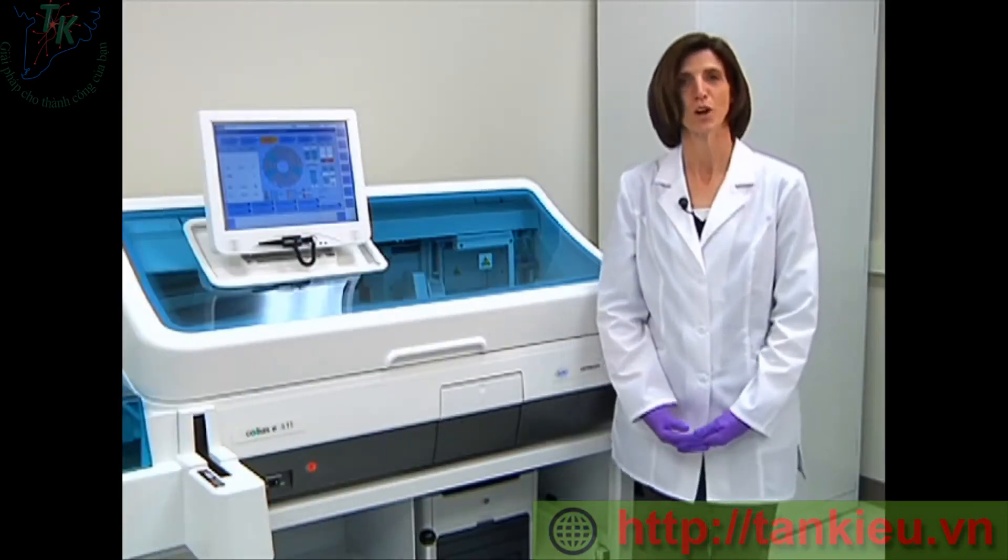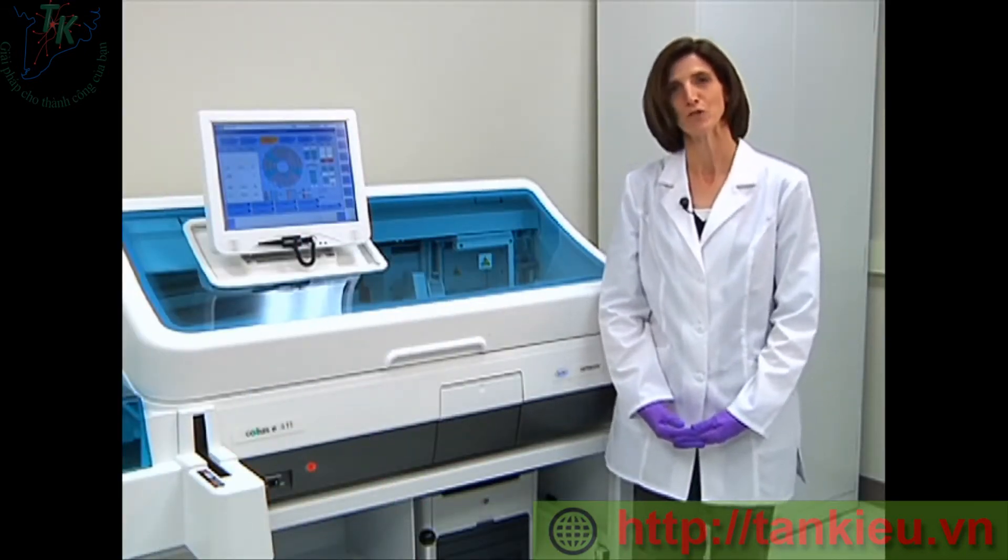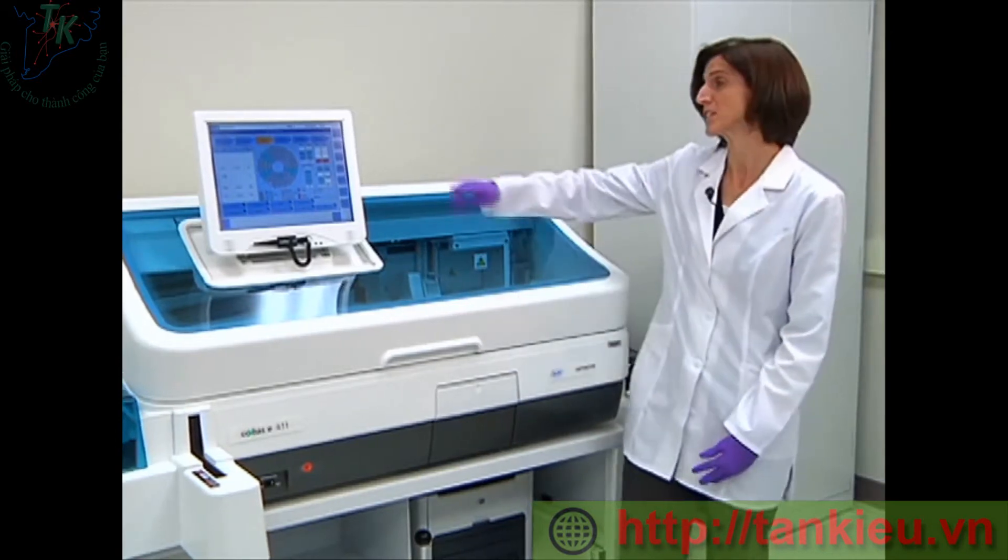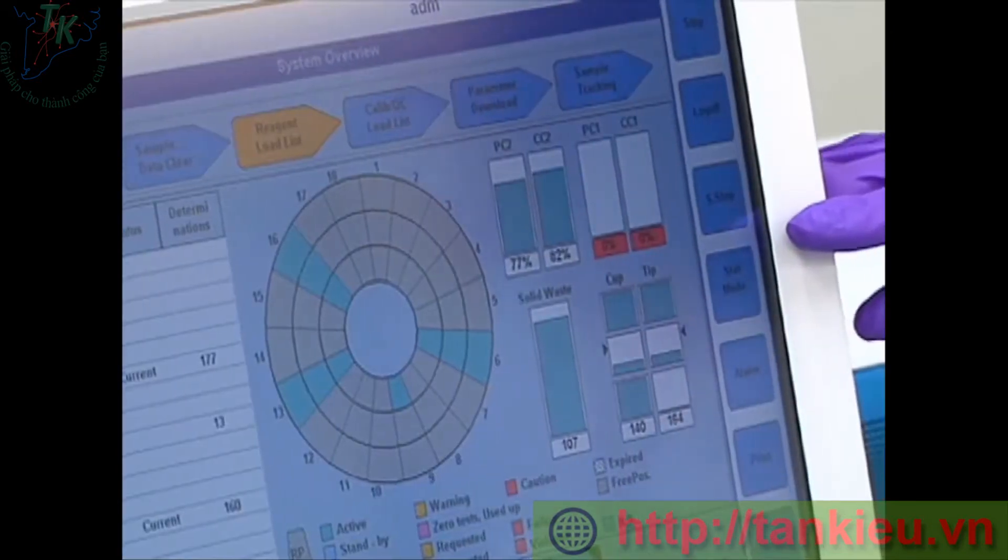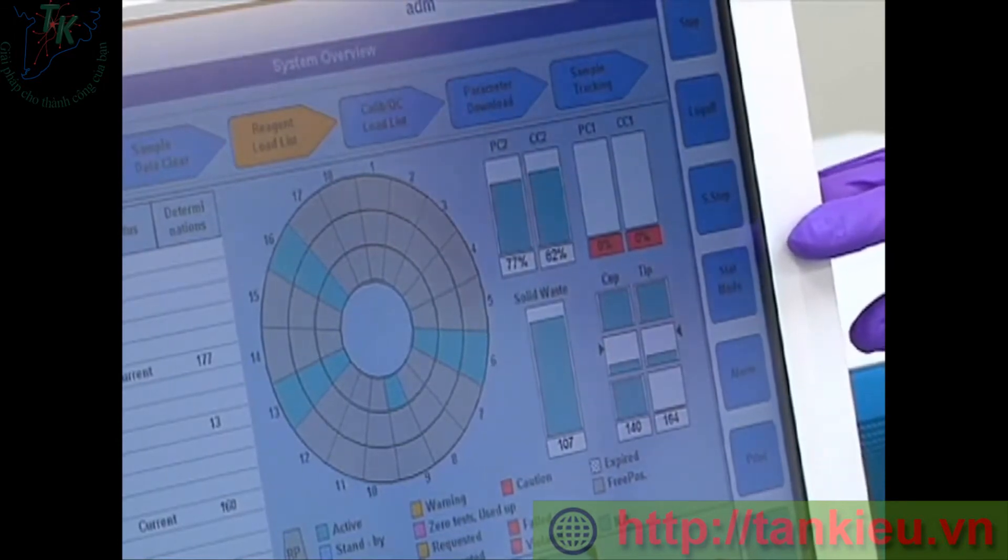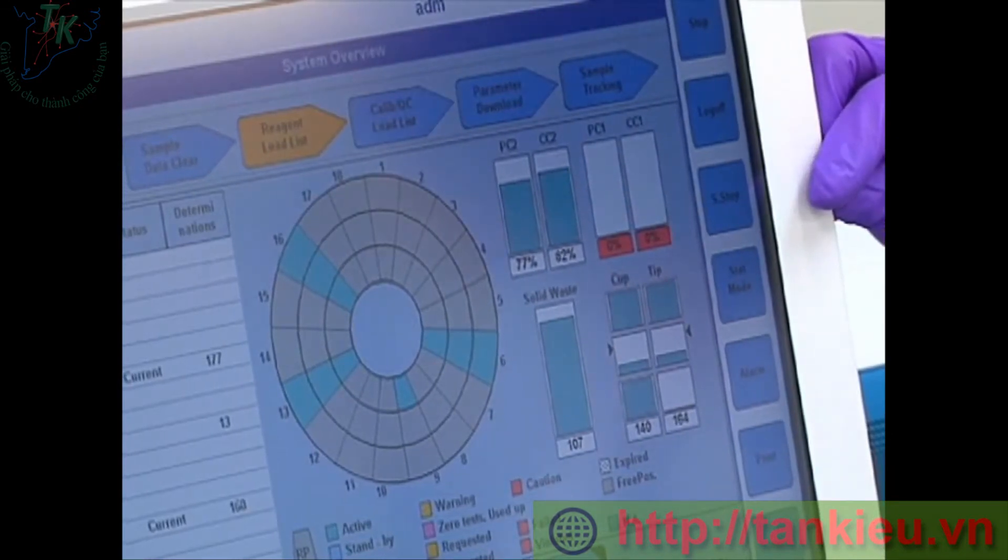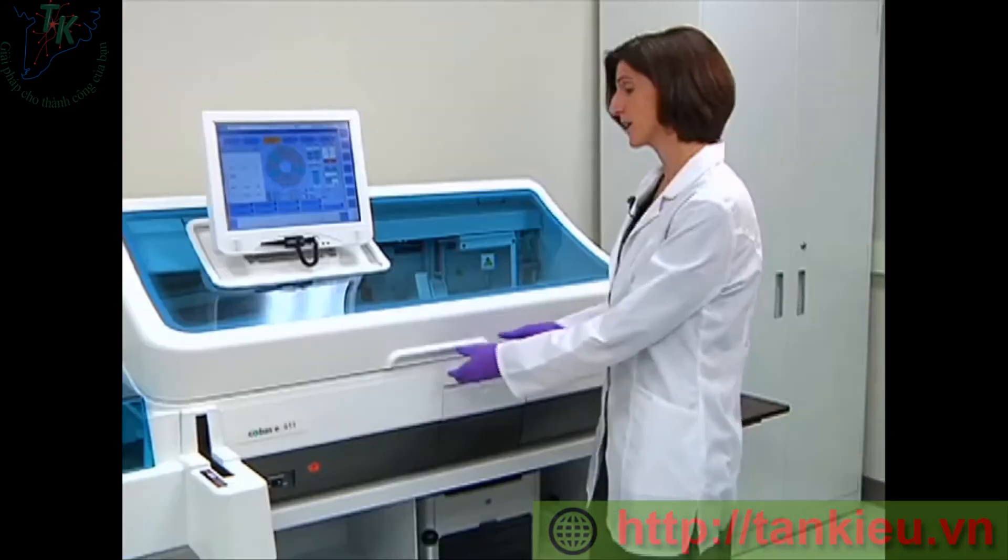So now we're ready to do our system reagent and hardware inventory checks, which is also known as your consumables. Again, the system overview screen will show us exactly what consumables are needed to be loaded. You're going to be able to see yellow or red on the screen to notify you of low volume. So we're going to open the cover.